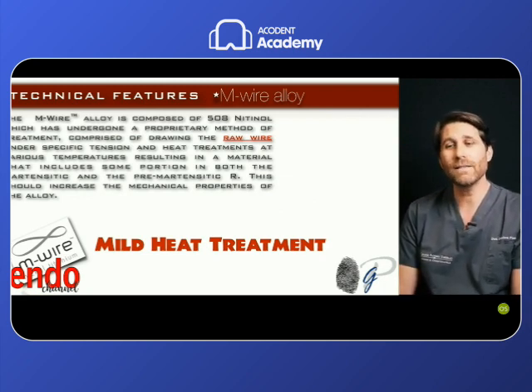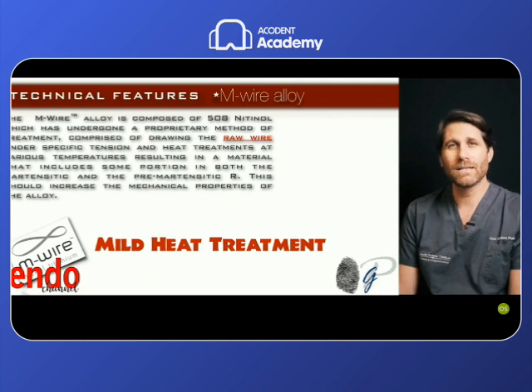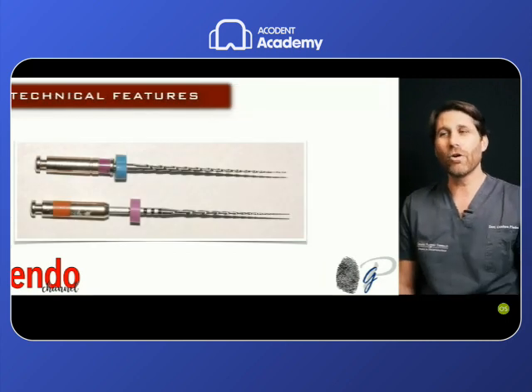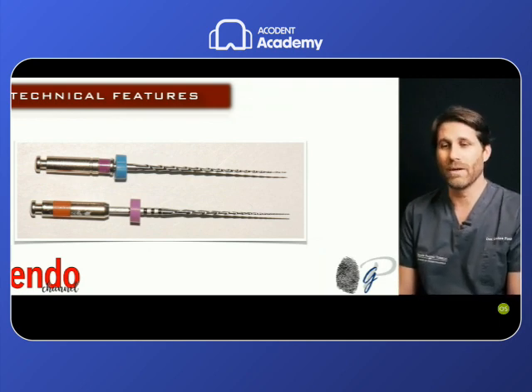If you have it in your hands, it is just similar to a standard nickel titanium, just with slightly enhanced mechanical properties, but in austenitic phase at room temperature. With this technical feature, we aimed to overcome some limits that rotary files had in the past to perform the mechanical scouting.